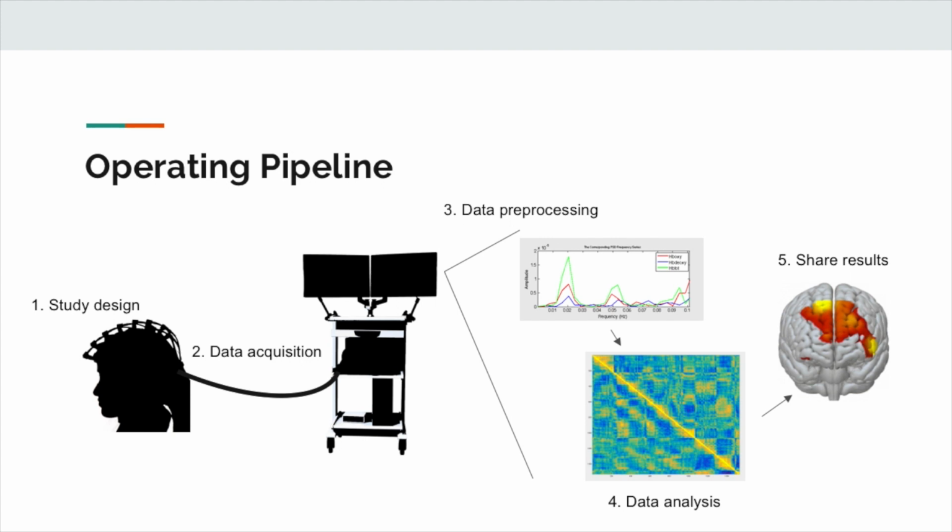And then there's the data pre-processing step that follows that. Just like in MRI, you have to pre-process the data, meaning you first have to do the modified Beer-Lambert law conversion so that you can calculate concentration from the light intensity values, which is the raw data coming out of the machine.